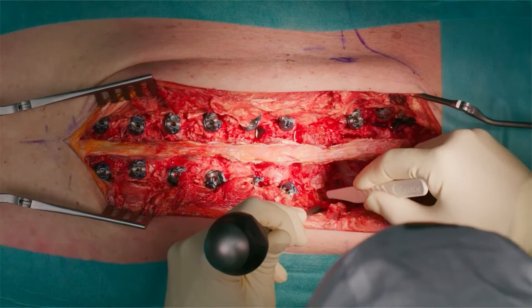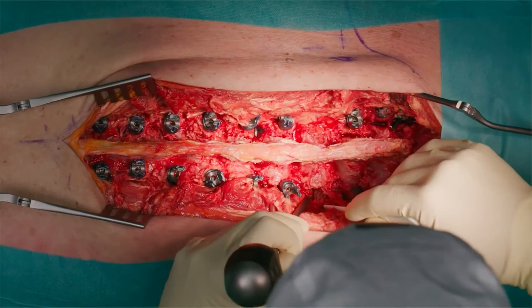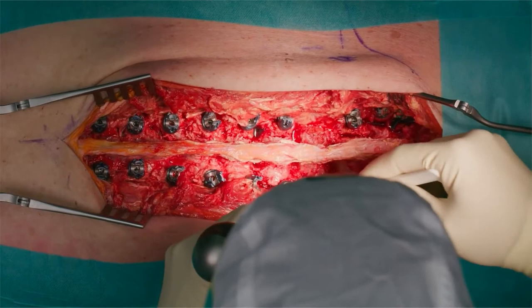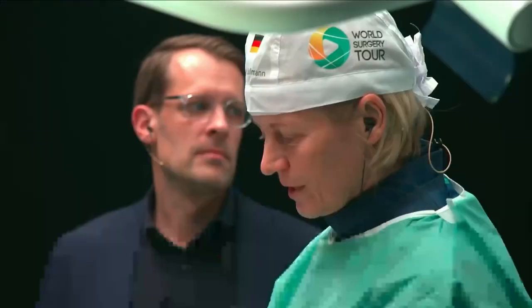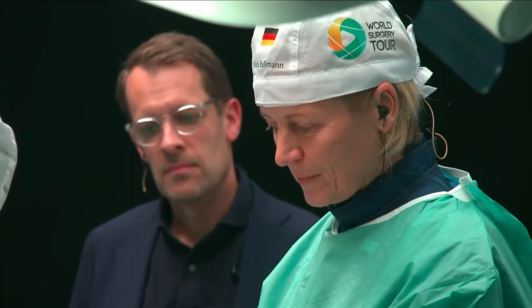This is the vertebra now being the most rotated. This is why we left it out. Normally in L3, in the direction — if you need lordosis or no lordosis — normally L3 goes downwards. You don't have lordosis or kyphosis there; the direction goes differently.